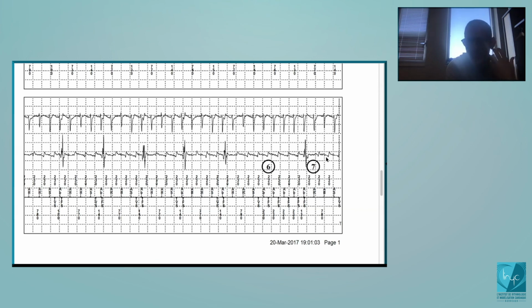So that's also something. Any manufacturers will have different problems. In Boston, you will never see T wave oversensing. Not never, but nearly never see any problem of T wave oversensing. But you may encounter problem of P wave oversensing. That's the other way around with Medtronic. You will see T wave oversensing, and if there is a problem of P wave oversensing, it's not all the time, but most of the time it's because you have connected a pseudo-bipolar lead, a Boston lead.